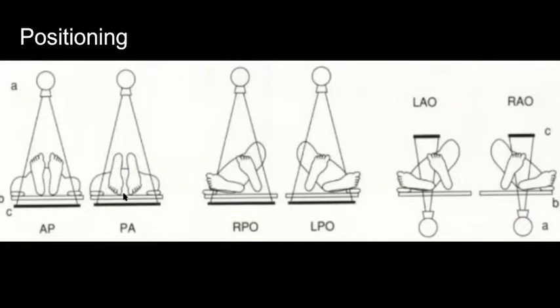In contrast, when you're turning towards the garage door with the flashlight beaming, the heart is closer to the door, so the heart will project smaller. Those are one way to differentiate AP from PA. Portable radiographs are typically acquired AP, and radiographs acquired in the radiology department are typically performed in the PA position because the image quality is better.